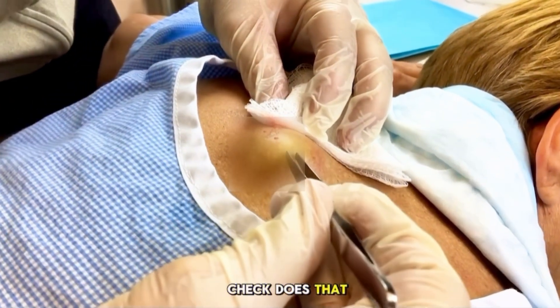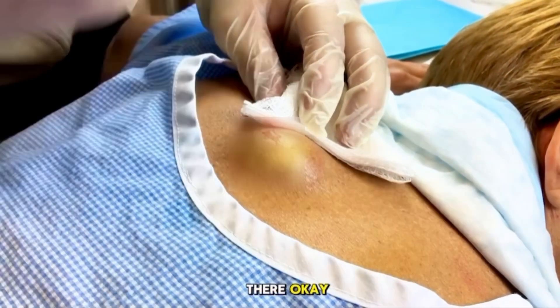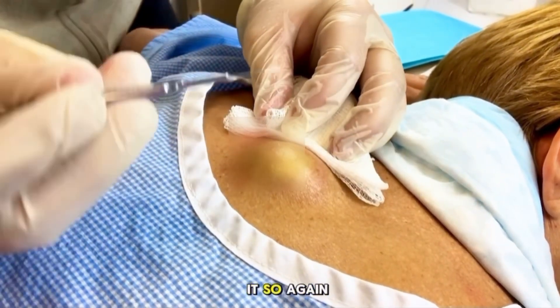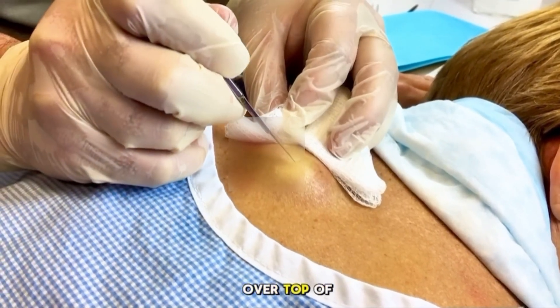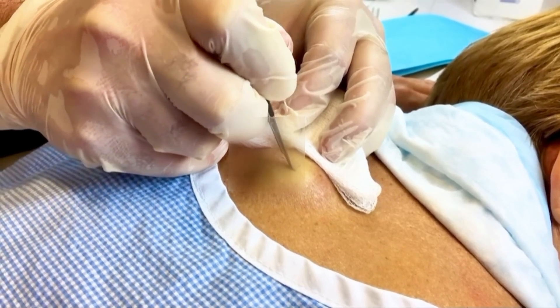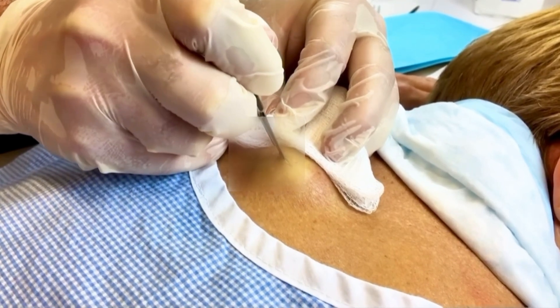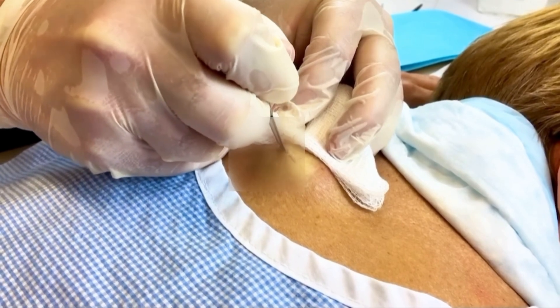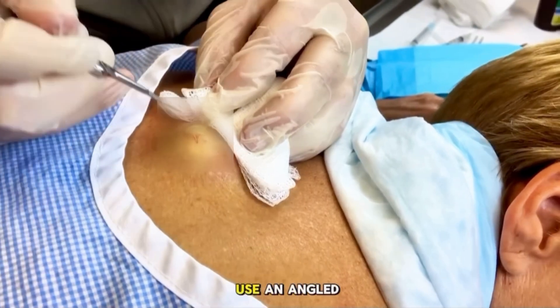I'd still check — does that hurt at all? No real pain there, not too bad. So now we're getting sized into it. This is a number 11 blade, and you have to be careful — residents are oftentimes right over top of this, and if you are, you can splash yourself. You'll notice with the blade I start to use an angled approach.